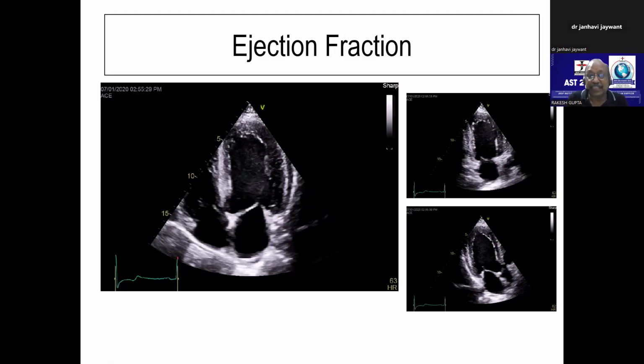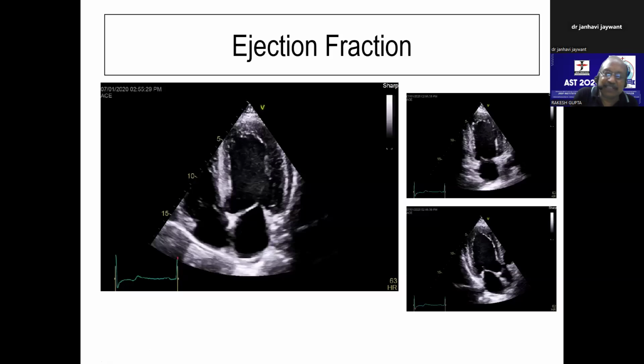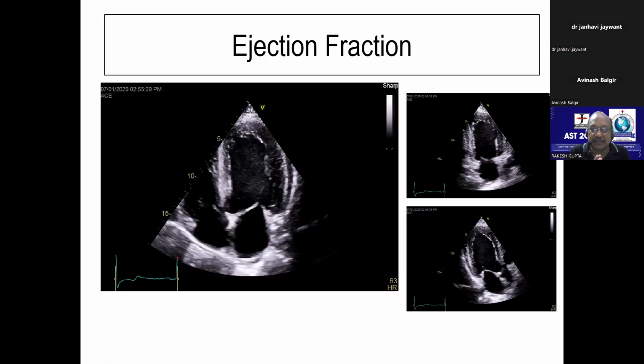Yes, sir. And the same thing I told you last time. If you look at the mitral valve VTI and you look at the LVOT VTI, the ratio of mitral to aortic velocity time integral, if it's more than 1.4, 1.3, that is suggestive of severe mitral regurgitation. Are you clear now how to look for MS, how to look for AS? A little bit of AS, not 100% of AS. So when we talk of aortic stenosis, we look at the stroke volume also. So how do we get the stroke volume? Here the mitral stroke volume was 55. How much was the stroke volume?